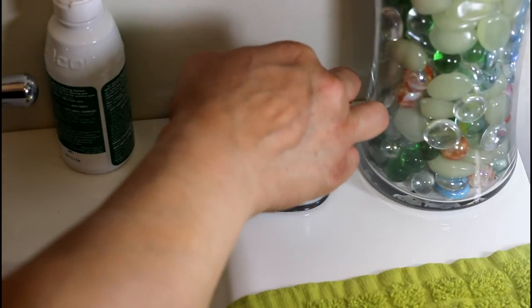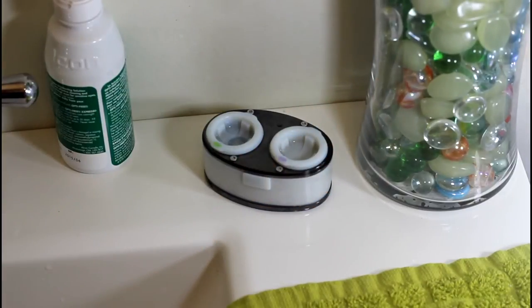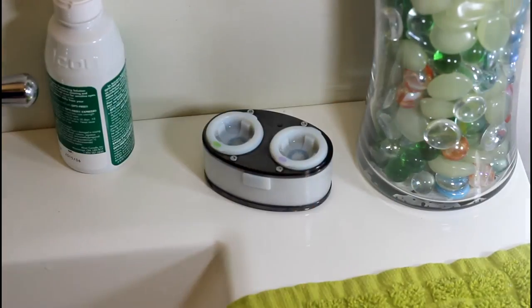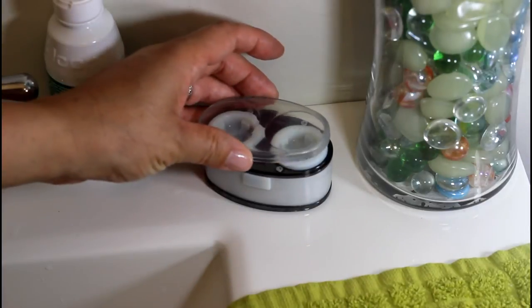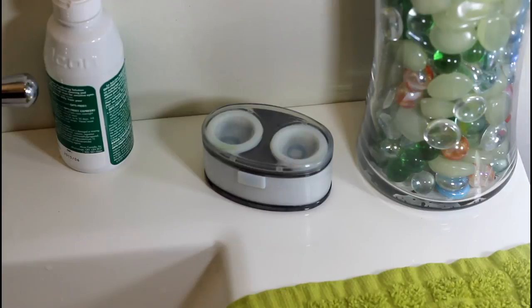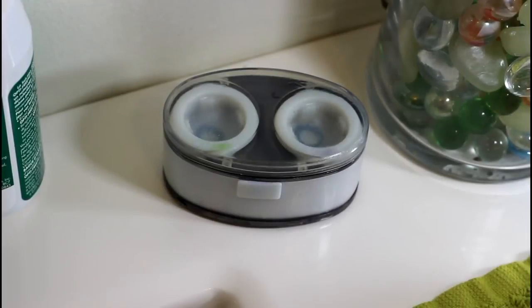That's it. What makes Swoosh so effective is that this innovative contact lens case has lens baskets that rapidly reciprocate, creating a powerful yet gentle agitation within the contact lens solution. This agitation is very effective at safely cleaning and disinfecting contact lenses.